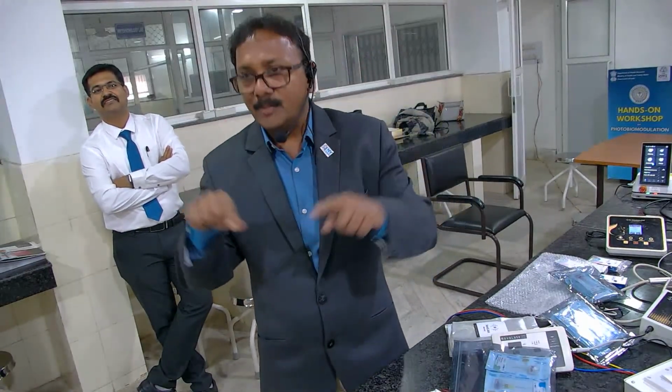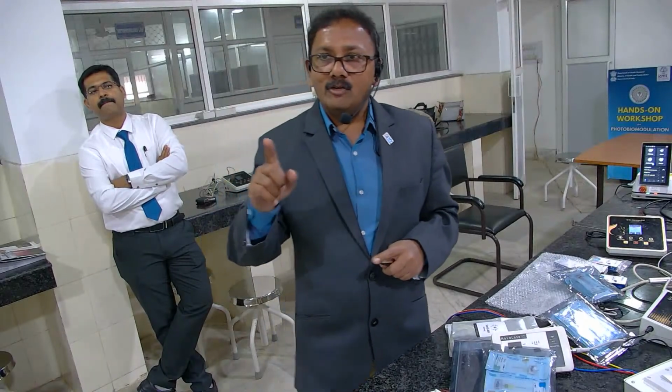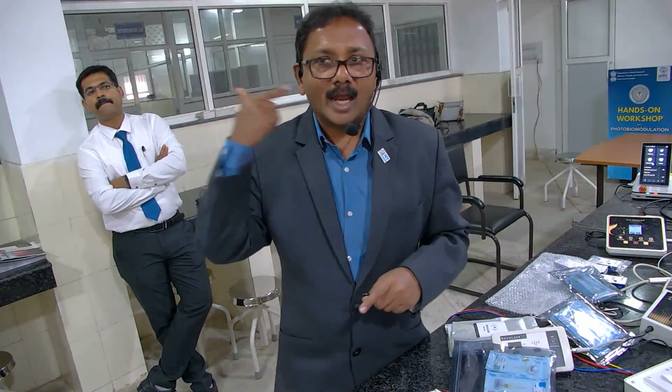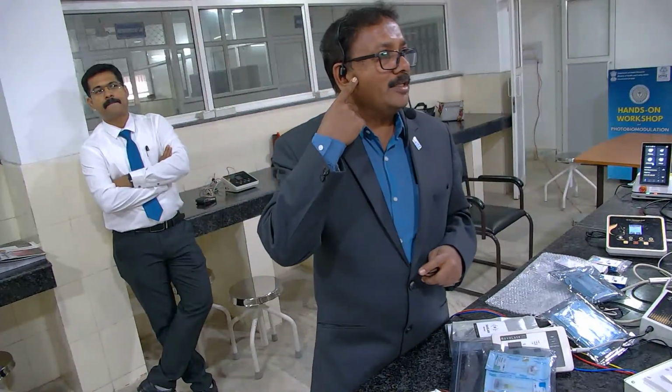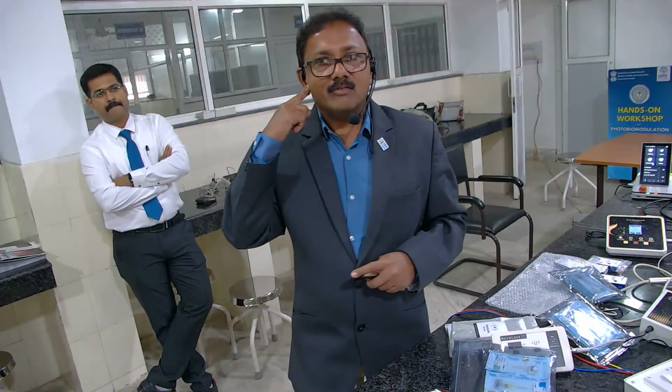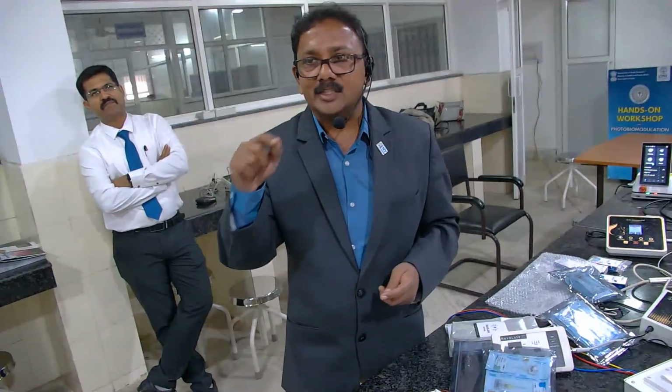The TMD part, Dr. Yagal sir will be covering in detail, because we have a 1 hour session only on TMD and craniofacial. He will make it very clear how it goes deeper, because other dentists were taught only to see the TMJ point and irradiate with either 8 mm or 3 mm in a particular direction.